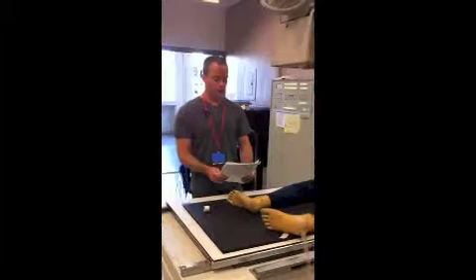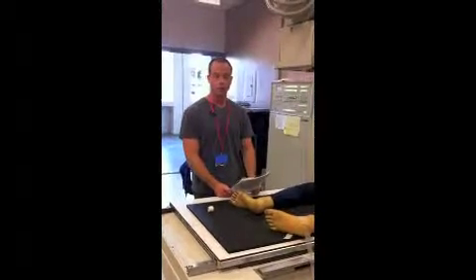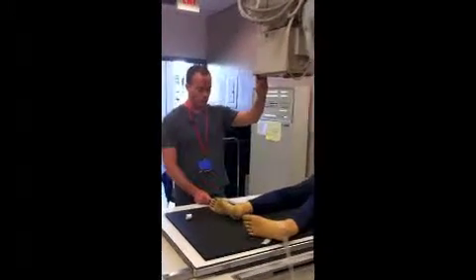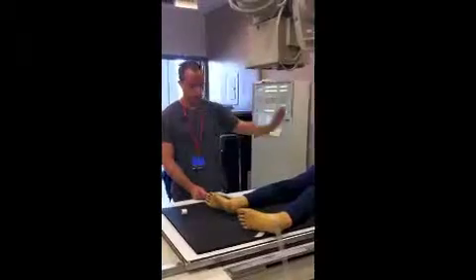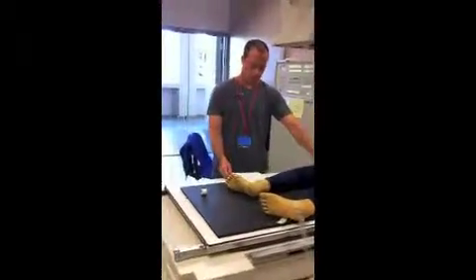Okay, this is for the tangential projection of the knee, the Settegast method, also known as the sunrise. The SID is 40 to 48 inches. The patient can be either supine or prone, preferably prone.